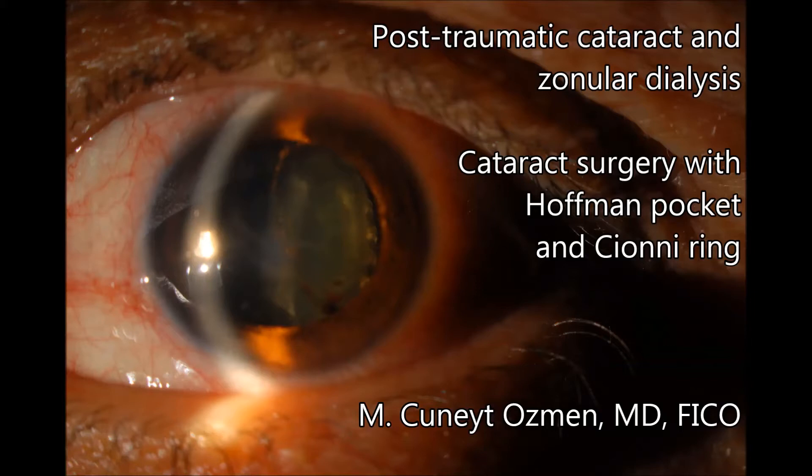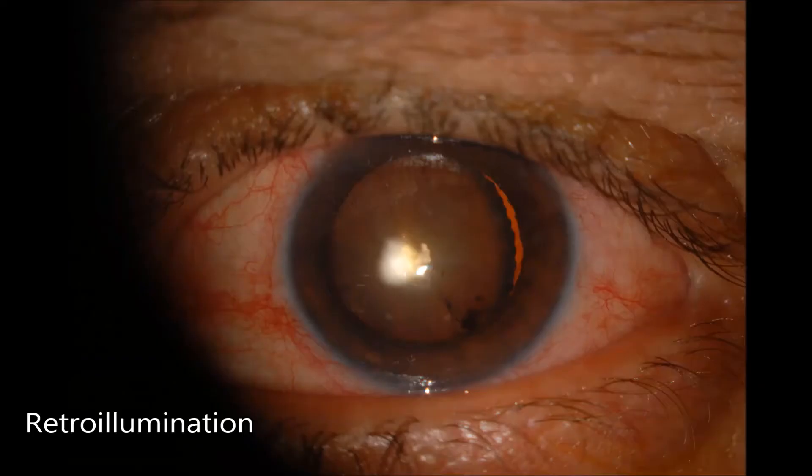Hello everyone! In this video I'm going to be talking about a 50-year-old male patient with post-traumatic cataract and zonular dialysis. In addition to the large zonular dialysis, the patient also has vitreous in the anterior chamber.